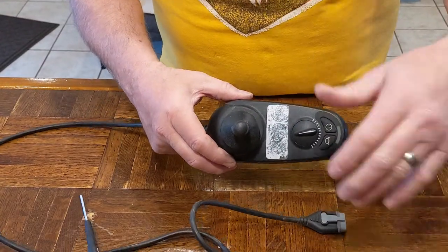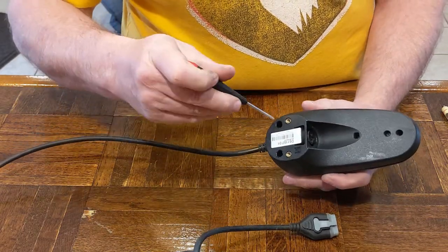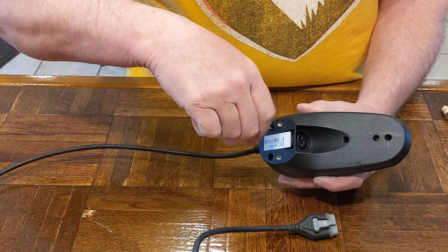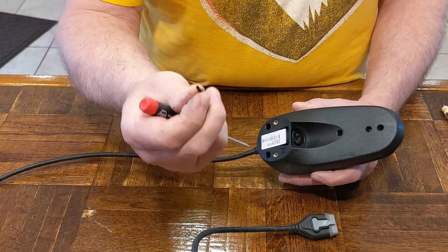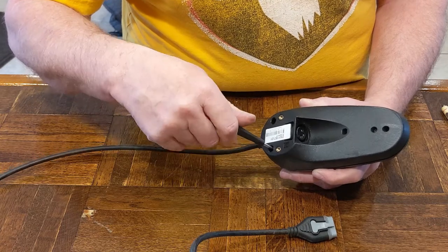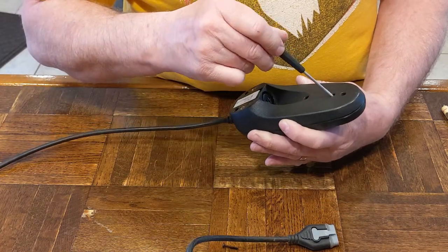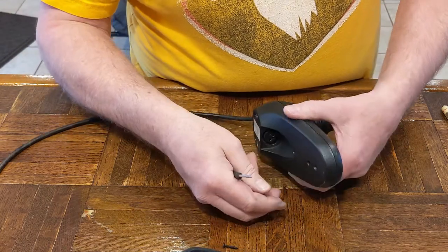It uses Torx T10 fasteners — I found two here and one here. I'm not sure what's under the third location yet so I'll see if the two get it open first. Now there's the plastic thread — hopefully you won't be going into this very much. You have to be careful when you put the screws back in not to strip them out because it's just going into soft plastic. This one feels like it might be stripped a little bit.